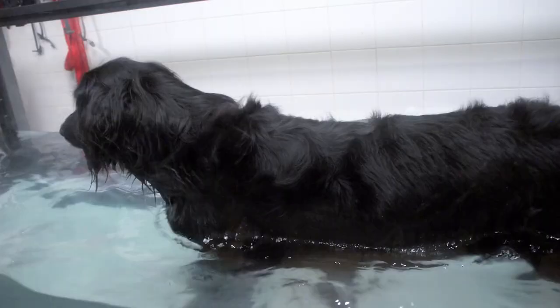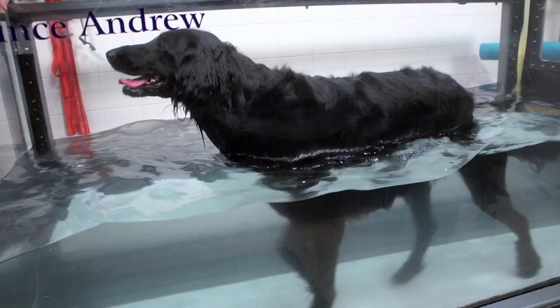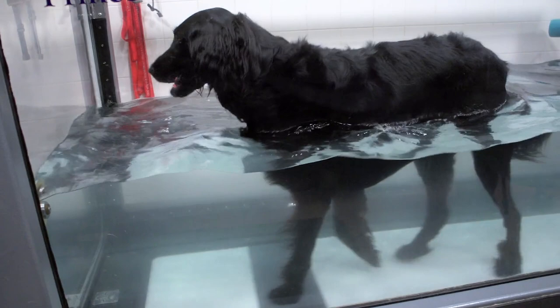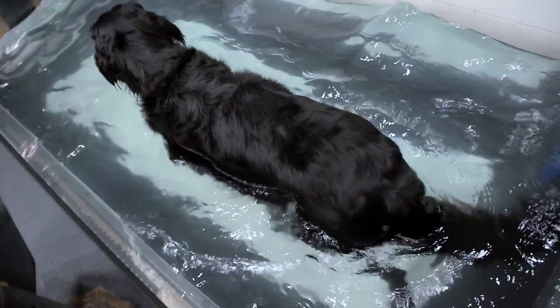I'm looking for the speed that the leg is advanced at. Sometimes when they start out, they advance quite slowly, and as they progress, they can pull their limbs through the water faster and their stride length becomes more rapid. The big thing I'm always looking for is symmetry. When there's asymmetry, you try to fine-tune what the asymmetry is and then keep improving it with every session.